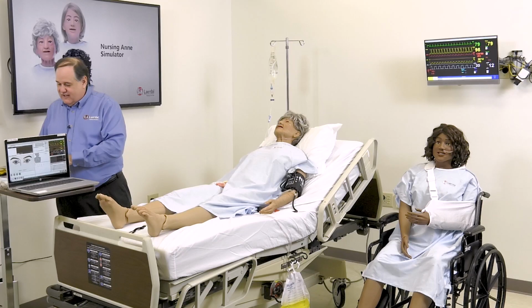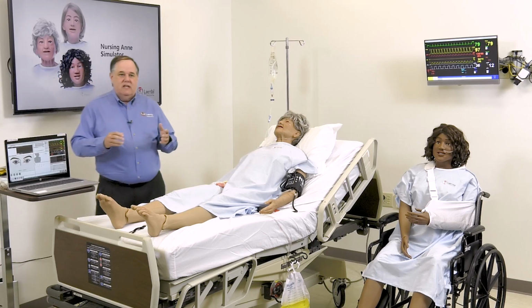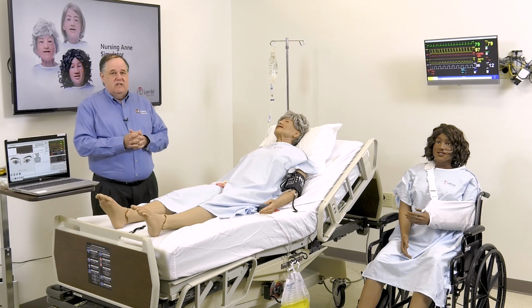Great, thank you. About the size of the simulator, height and weight: I think she's about 70 pounds and comes in at 5'6" for her total measurement.